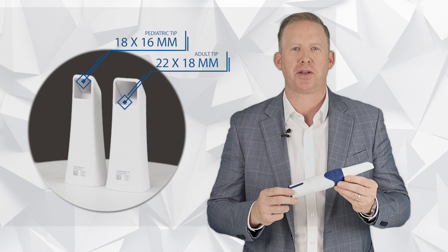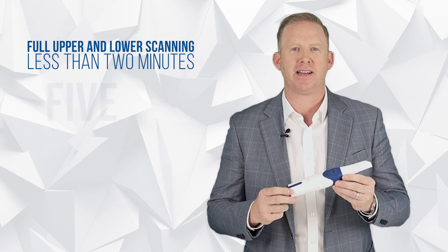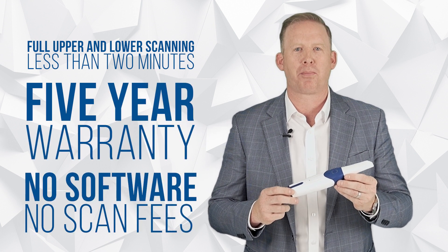With two tips to choose from — adult and pediatric — full upper and lower arch scanning in less than two minutes, a five-year warranty, and no software and no scan fees, all at a lower price than other intraoral scanners that are on the market.